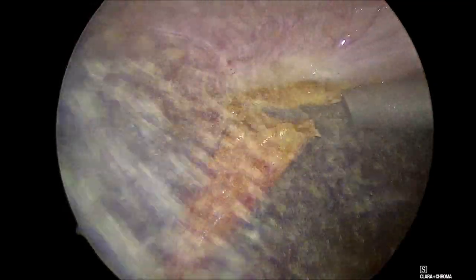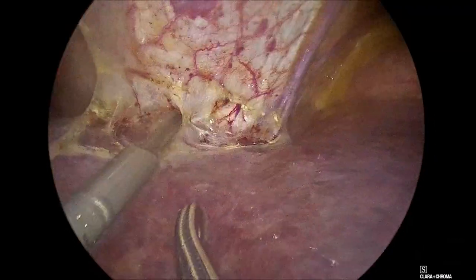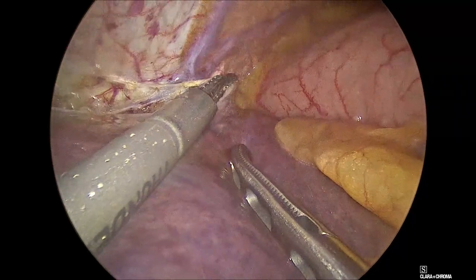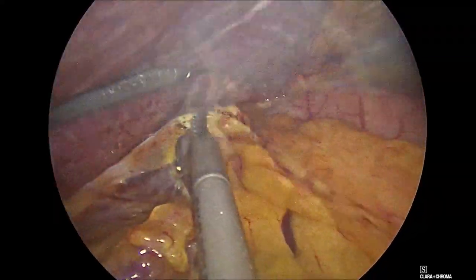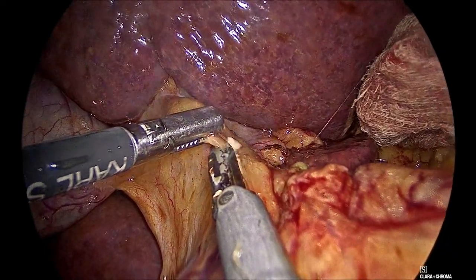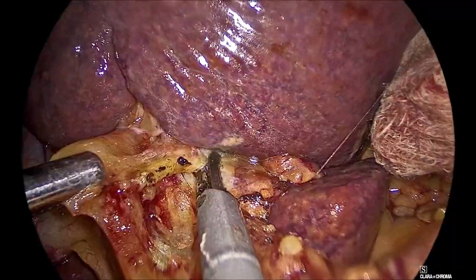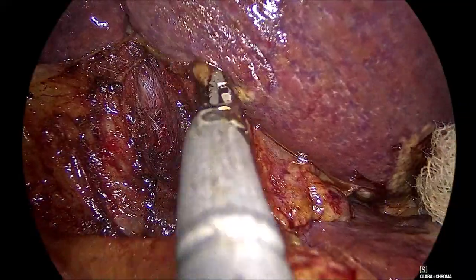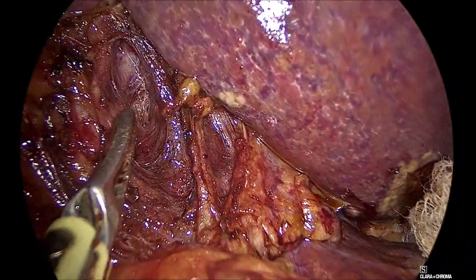We took down the falciform ligament, then the left triangular and coronary ligaments. The gastro-hepatic ligament was also taken down to the level of the ligamentum venosum. We then started dissecting the hilum and opened the peritoneum over it. Because of chemotherapy, there was significant fibrosis of the tissues surrounding the hepatoduodenal ligament — usually it is loose areolar tissue, but here it was fibrosed — so care was taken to avoid inadvertent injury to any major vessel.